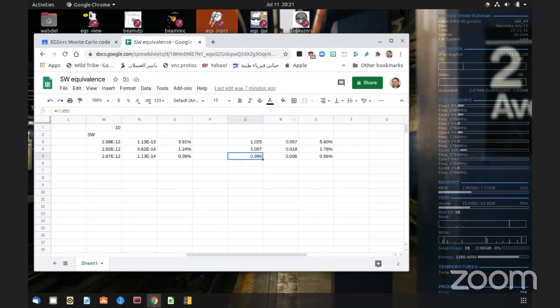Okay. Dr. Omid, I have 2 questions here. What if we use the ion chamber in the middle of the field, in the central axis? Yes. What if you were off axis, let's say 5 centimeters off axis from your field? So now I think the situation will be worse, right? But you have a large field.